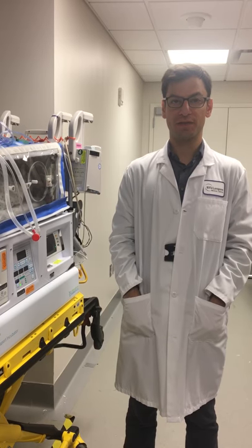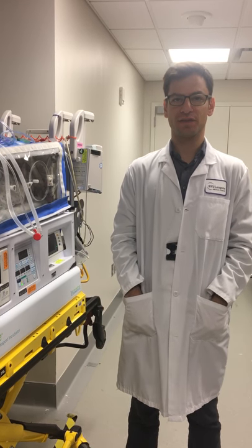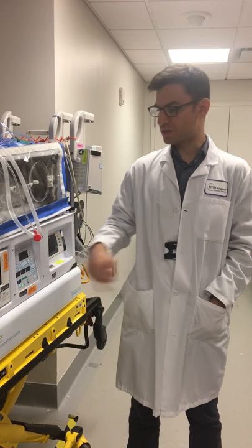Welcome to another NYU Respiratory Department Neo-NATO transportation training video. Today we're going to talk about conventional ventilation with the cross vent ventilator.